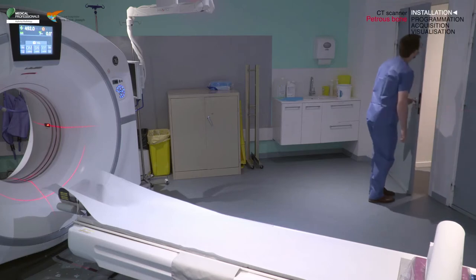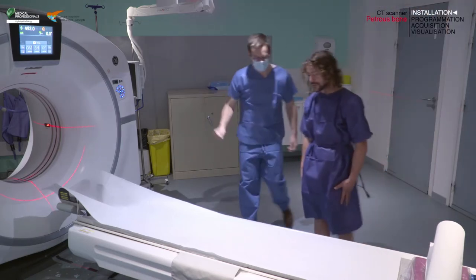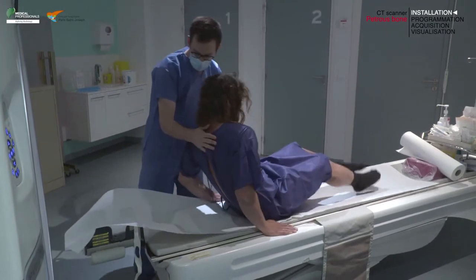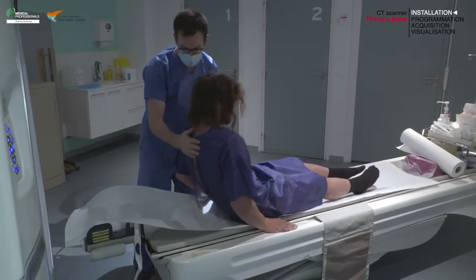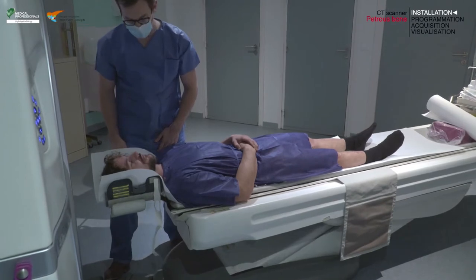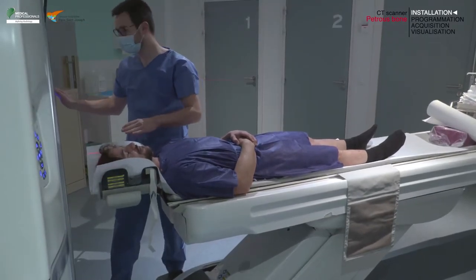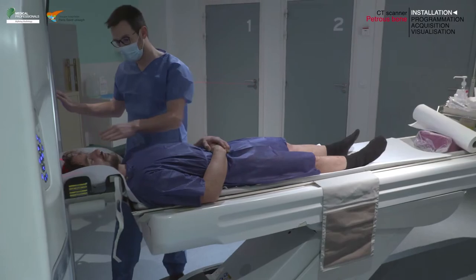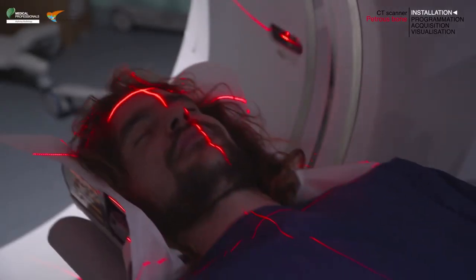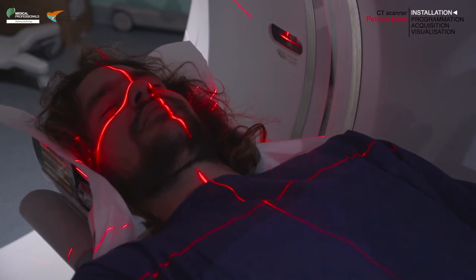After verifying the patient's identity using at least two identifiers, such as first name, last name, and date of birth, place your patient in a supine position with their head settled in the head holder and their arms resting along their body. Center the internal axial plane laser light through the tragus and the lower edge of the eye, with the patient's head tilted back slightly.